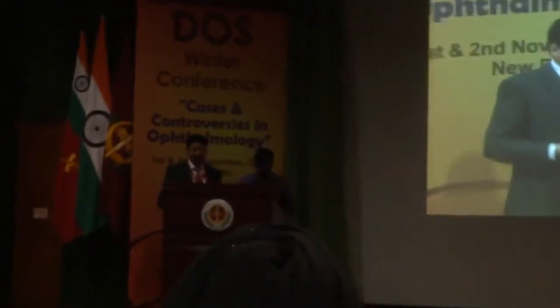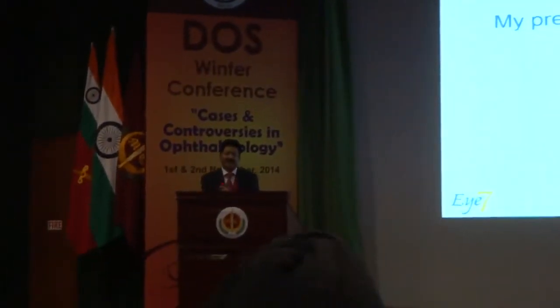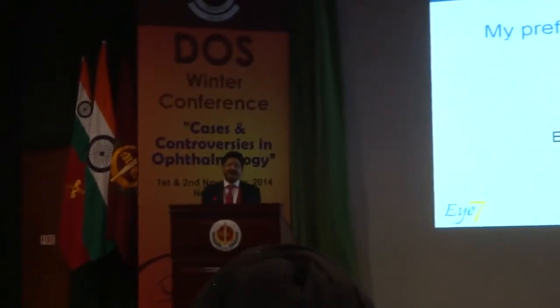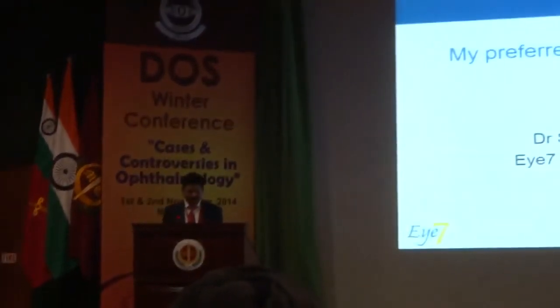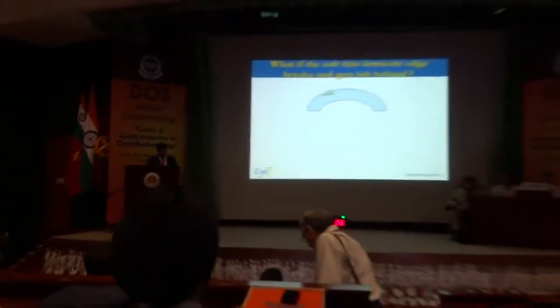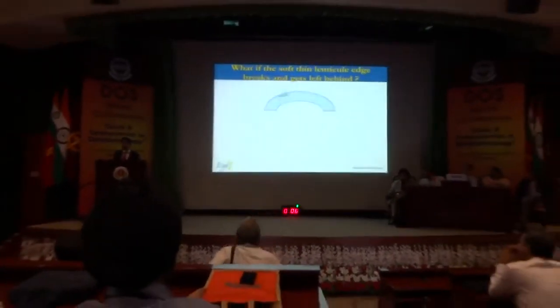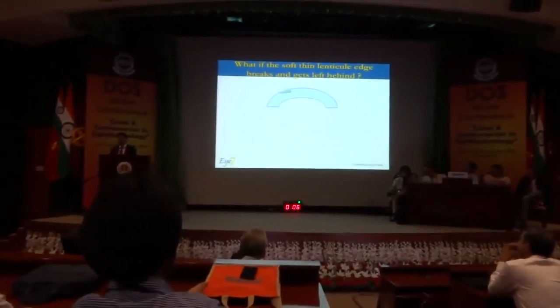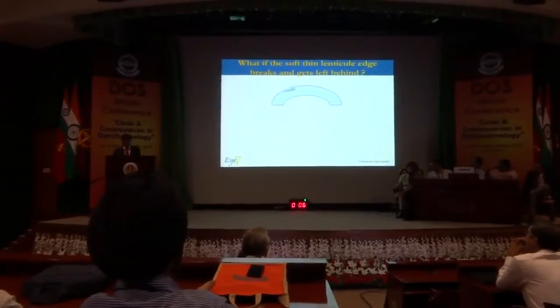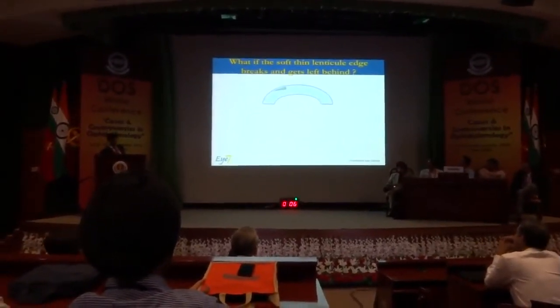You've seen the bright side of smile. I think it's time the audience saw the dark side of smile. And I am here to reaffirm your faith and confidence in the good old standard technique, which is the Lasik. Okay, now let's look at this situation. What happens when a small thin edge of the lenticule breaks and gets left behind within the eye? Something like this.